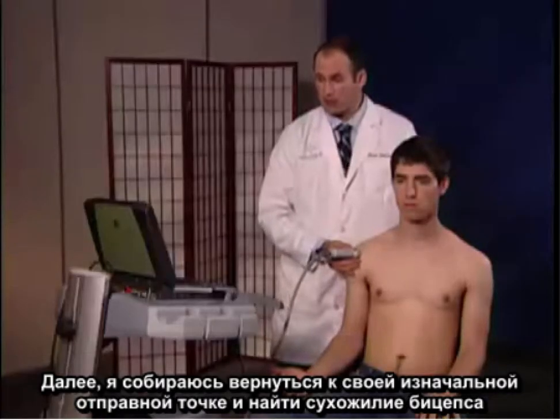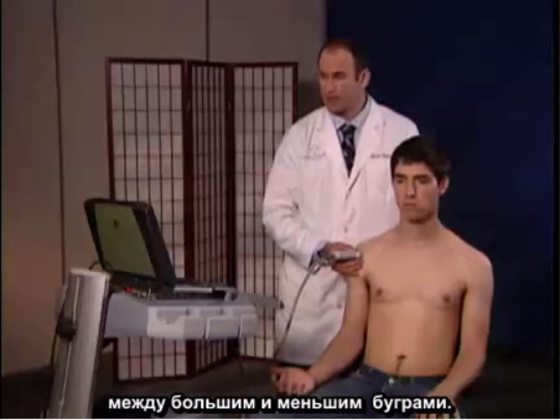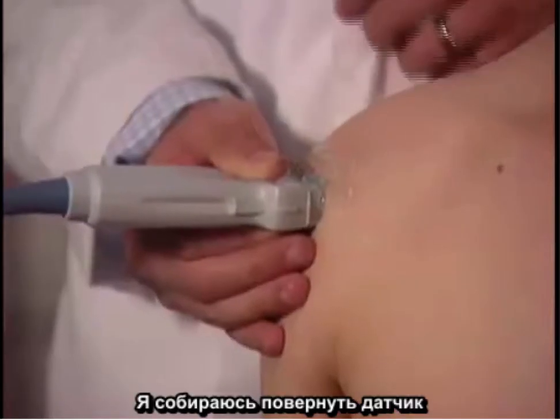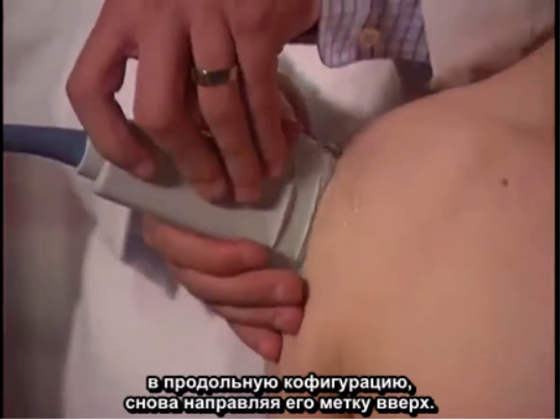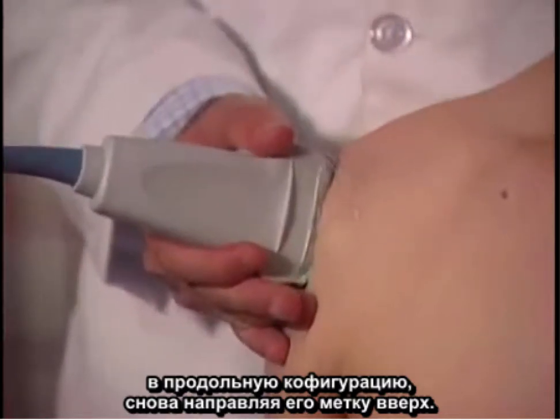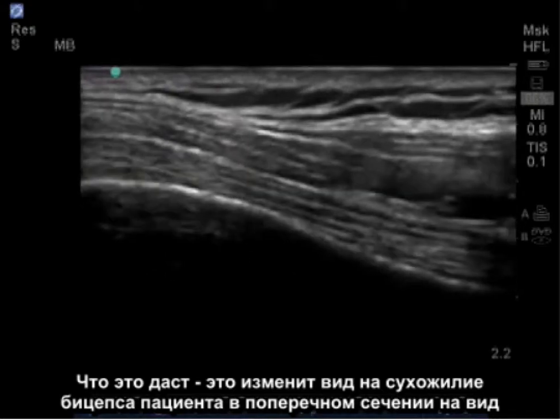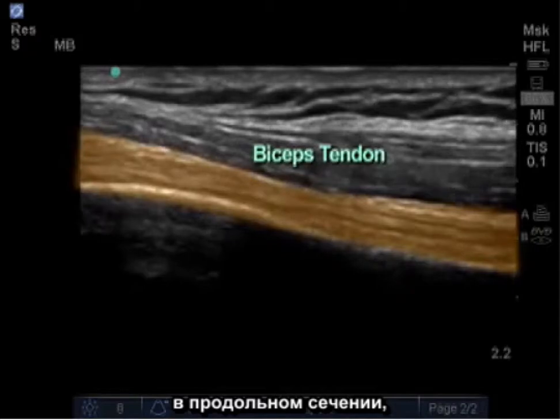Next, I'm going to go back to my initial starting point and find the bicep tendon between the greater and lesser tuberosities. I'm going to turn the probe in a longitudinal manner, again maintaining the notch of the probe upward. This is going to change my view from cross-sectional to longitudinal of the patient's bicep tendon.